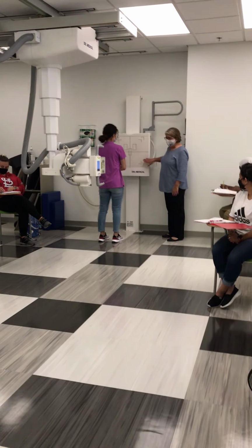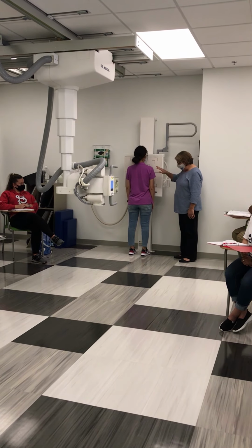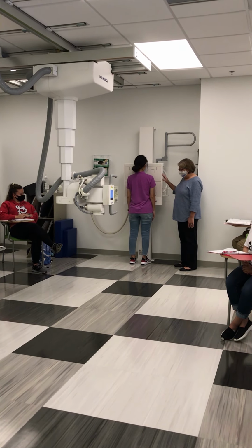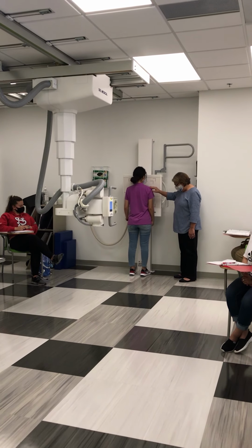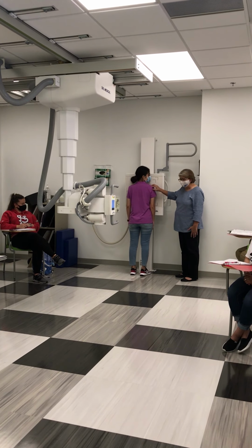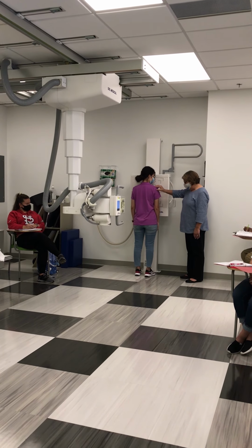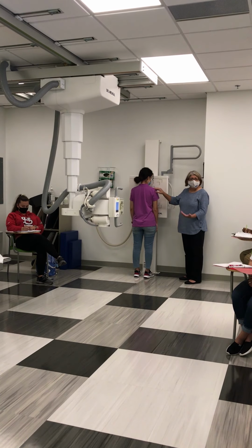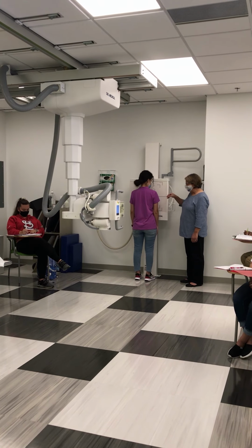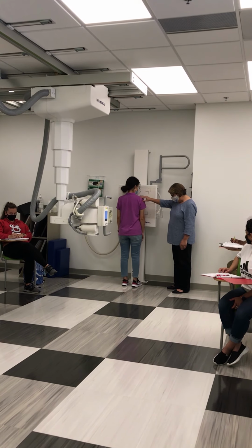Now then, ma'am, I want you to stand with your chest up against that board. Walk right up to that. Like that? Mm-hmm. We want to make sure that our patient is vertical and not leaning toward the wall bucky. So take a tiny step back. So let's say our patient was leaning and we want her closer. Or let's say that she's standing upright, but we can definitely see there's a gap between her and the wall bucky. Rather than just have your patient lean in, you would say, take a step toward that board.